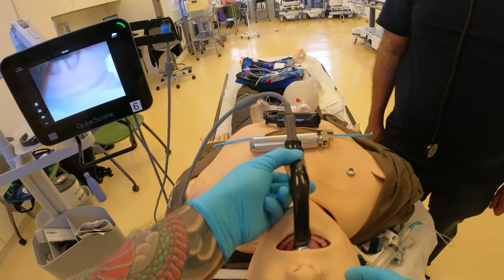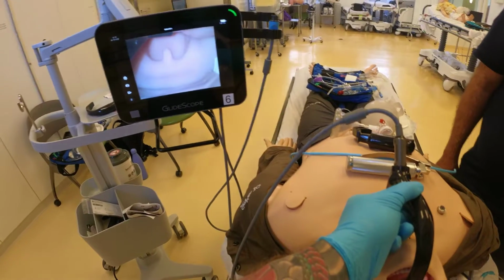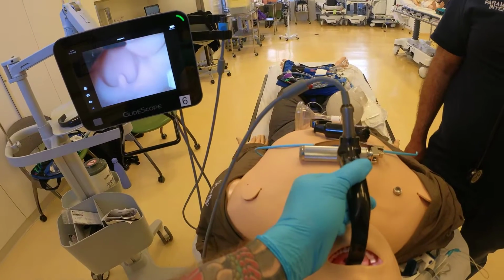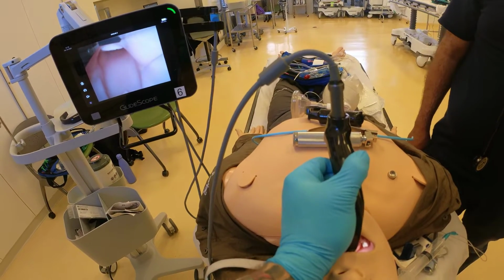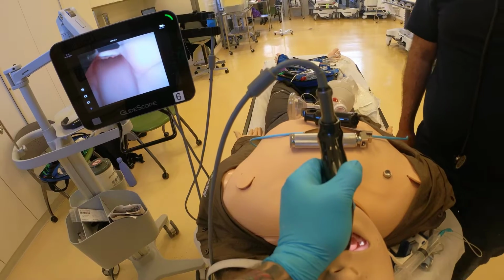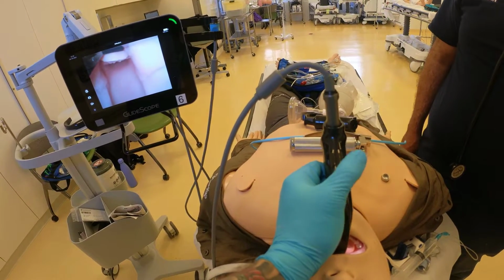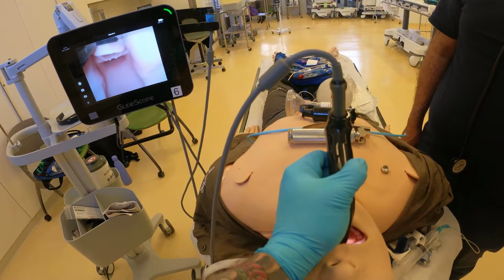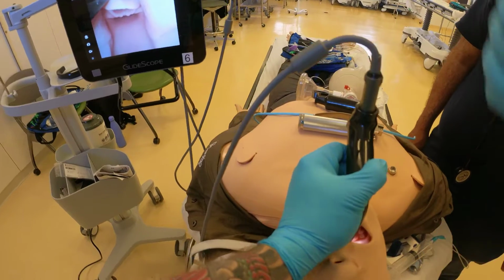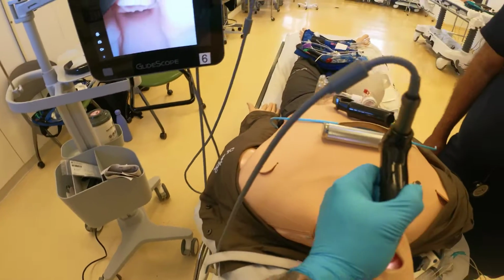And the first thing I want to see is the uvula. So on the screen, we see this aspect right here is the uvula. After the uvula, I want to see the epiglottis. So as I'm advancing, I see the epiglottis. And what I want to do is sit the blade in the vallecula. And when I do that, I'm going to engage the hyoepiglottic ligament, and this will pull my epiglottis forward. And here at the bottom, you see this is the interarytenoid notch. And this is what I want to see.